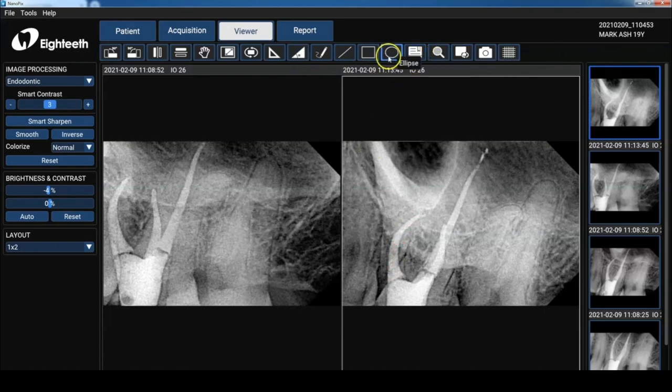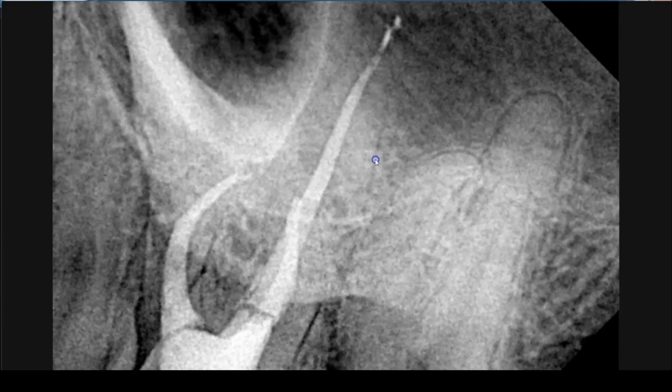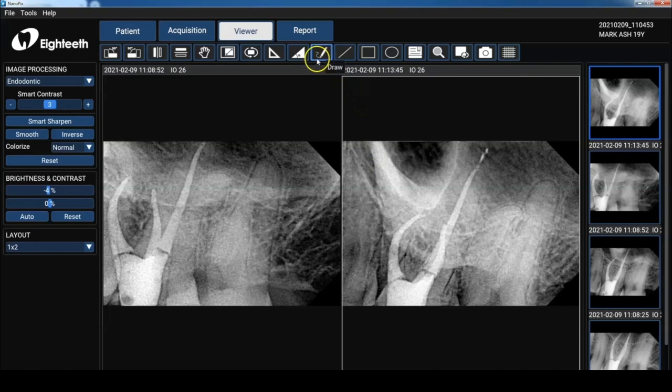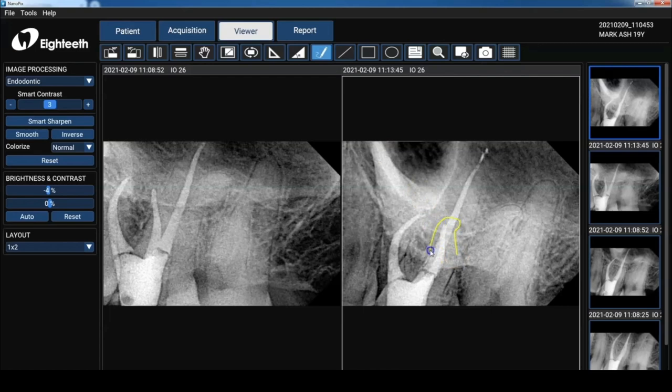And I forgot to mention, if you double click on the image, it blows it up to full screen. So if you're talking with your patient, it's really easy to get to full screen. I'm going to use this drawing pencil just to trace out my PDL on this healthy root. Now this root canal is about five years old. So yes, they do work. And if you want to remove that drawing, you just click clear overlays.